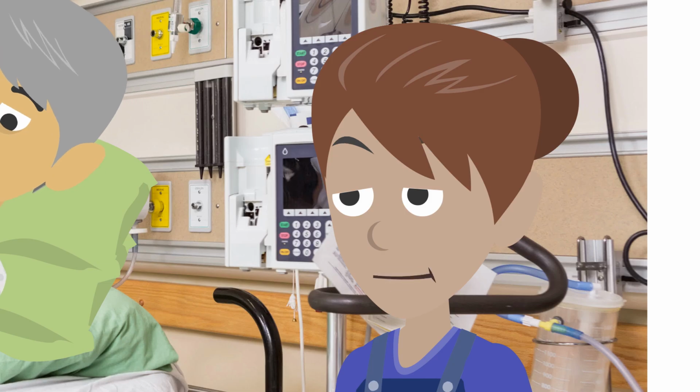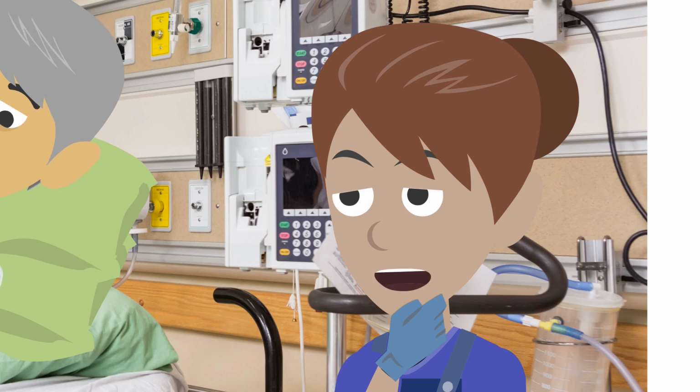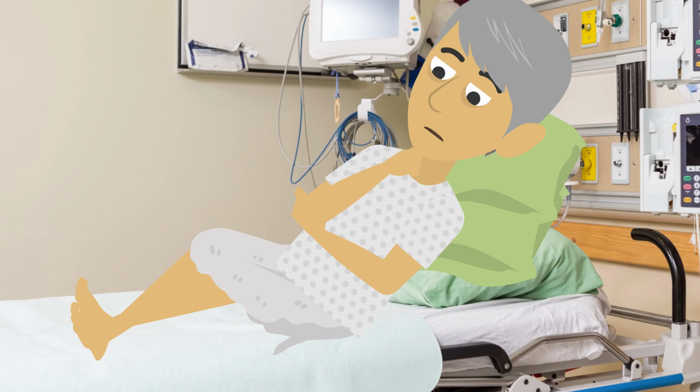Now I'm going to measure the tube from your nose to your earlobe and breastbone and add a bit extra as I explained before. I'll just take note of the mark on the naso-gastric tube so I know how far to put in the tube. Before I put in the tube, I need to check that your nose is clear. Can you please sniff with one nostril closed for me and then repeat with the other side? Sure.